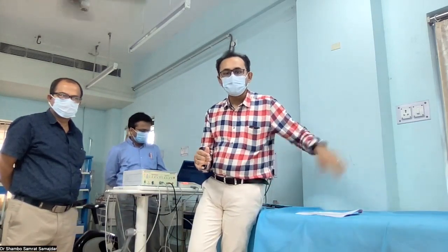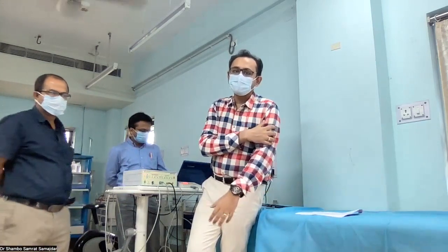What are they? Number one, to check orthostatic hypotension. So what is orthostatic hypotension? First of all, the patient will lie down here. We need to check the blood pressure, and after that we ask the patient to stand up, and for 3 minutes he will stand. Then we need to check the blood pressure. If there is a systolic blood pressure fall of over 20 millimeters of mercury, and or a diastolic blood pressure fall of more than 10 millimeters of mercury, then we can call it orthostatic hypotension.